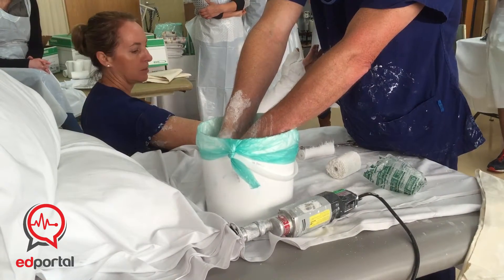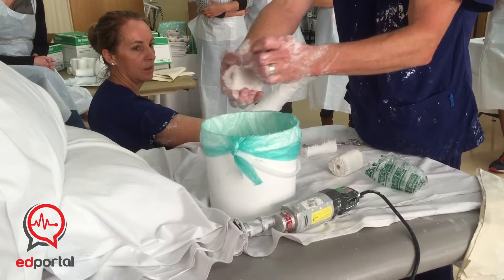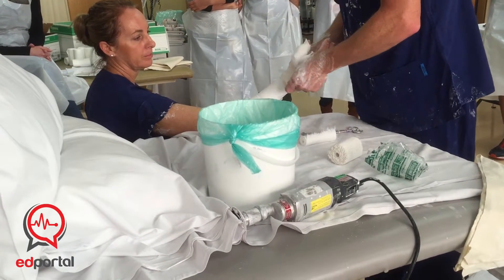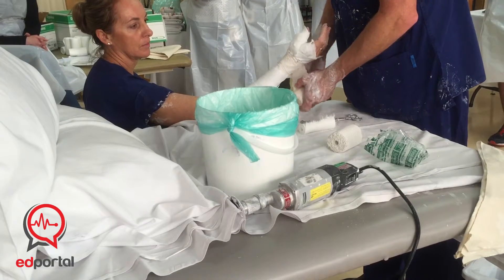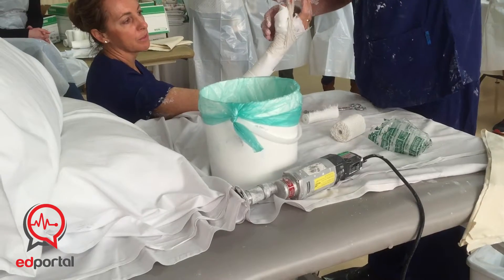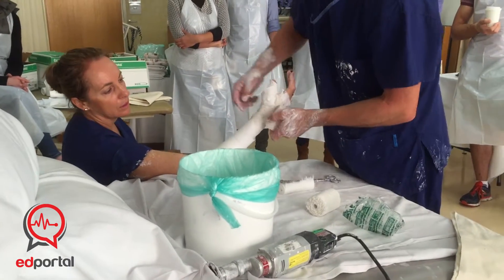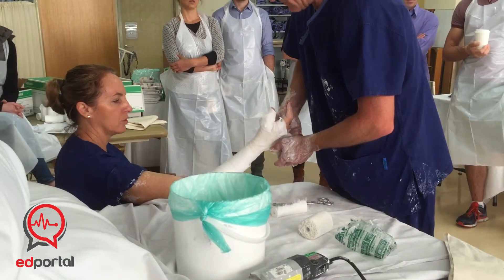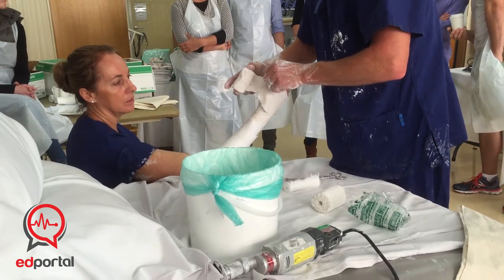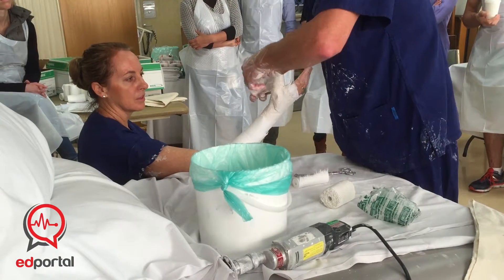Same as a below-elbow cast — starting at the wrist, a couple of rounds around the wrist, and then coming up through the web space, up to the palm and across. With the plaster you can mold it and drape it anywhere; it will smooth out, so don't worry about it not looking very tidy at this point. Around the thumb a couple of times.